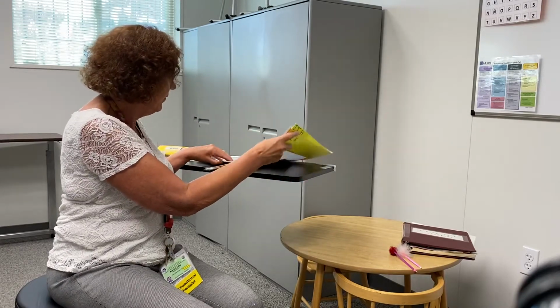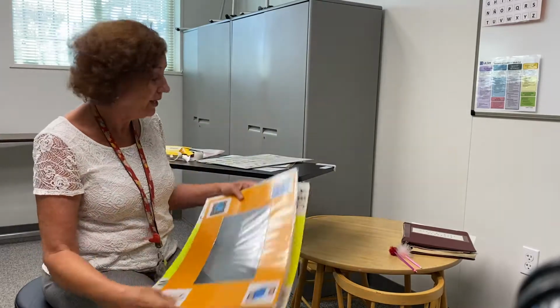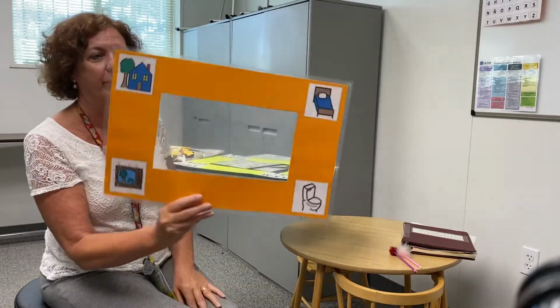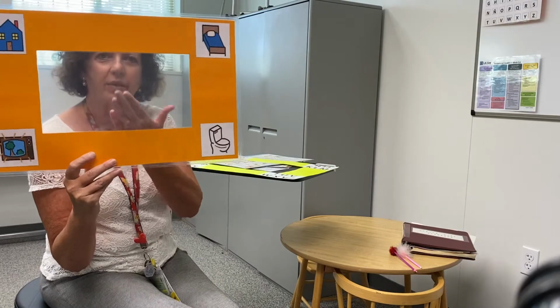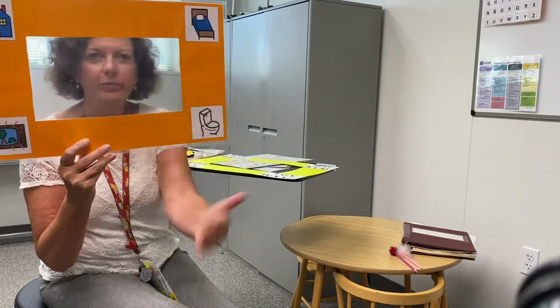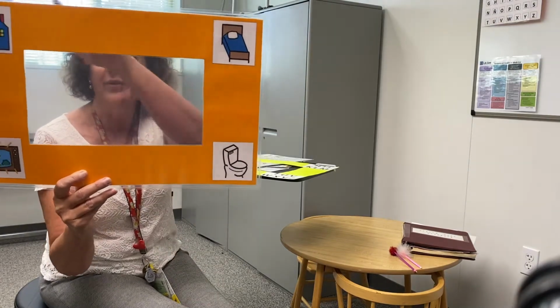And if they cannot move anything, they can't move their hands, they can't move their head, we have something called a manual eye gaze board. As a therapist, I would put this in front of my patient, who is you right now, and you would use your eyes to look at the bed or the house.